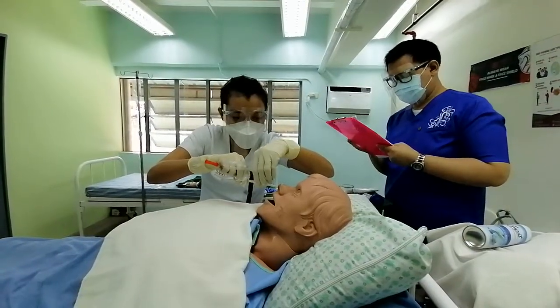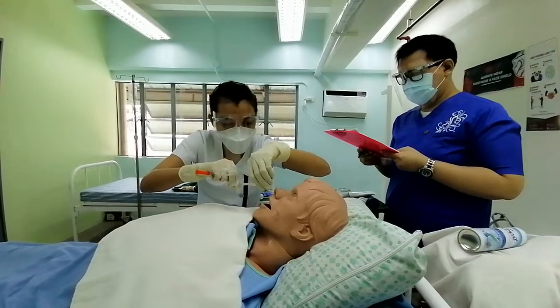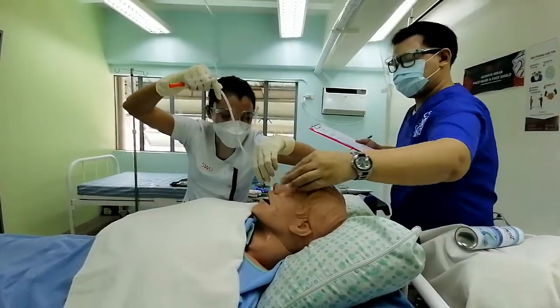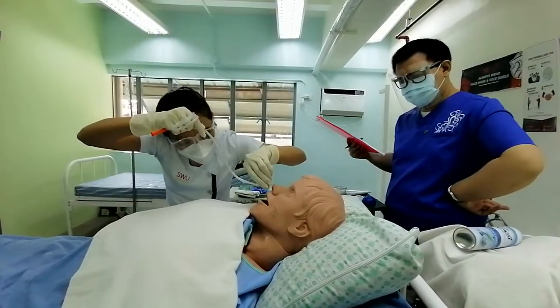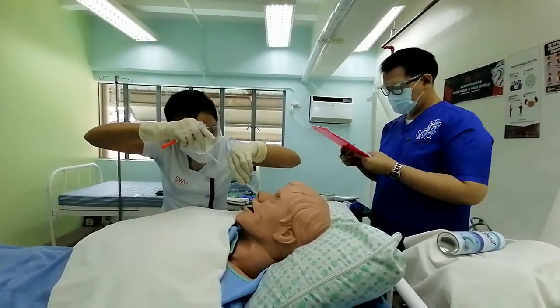Also, during this time, I should be mindful of the non-verbal cues of the patient, because this is the time when the patient is feeling uncomfortable. Push on, up until the mark.